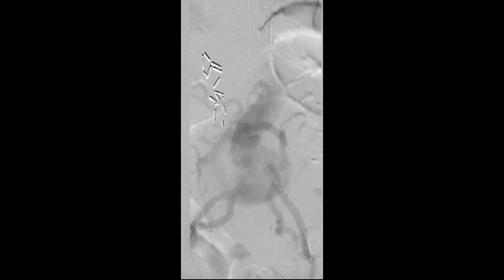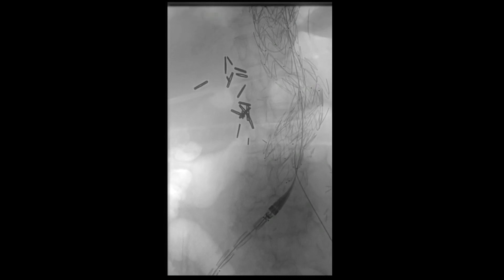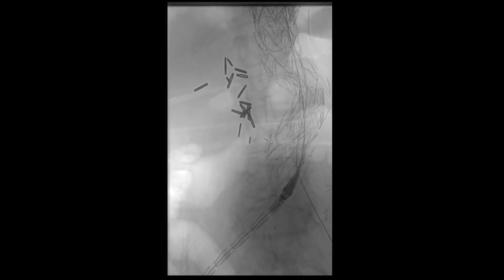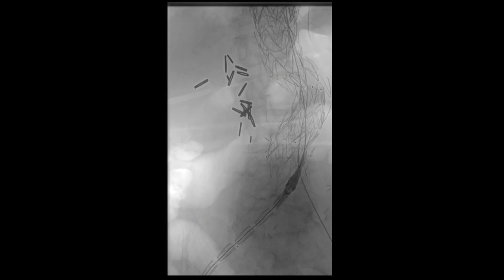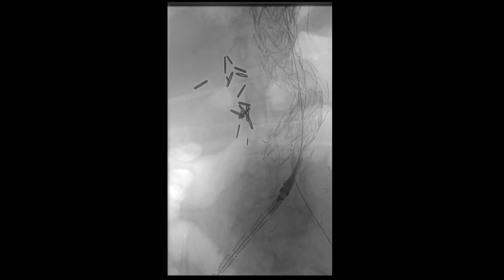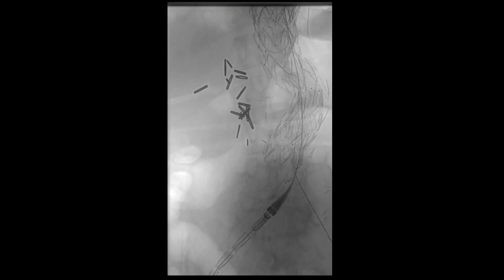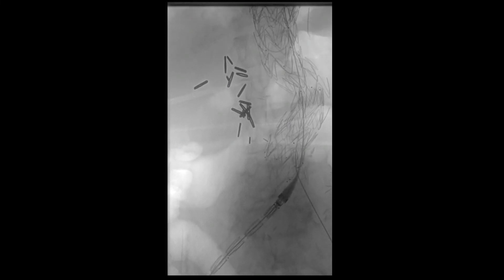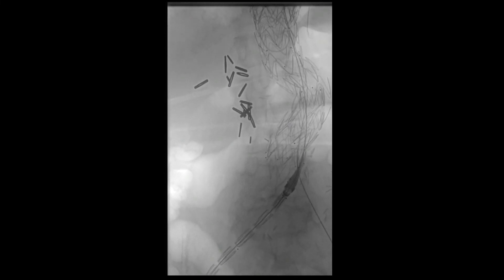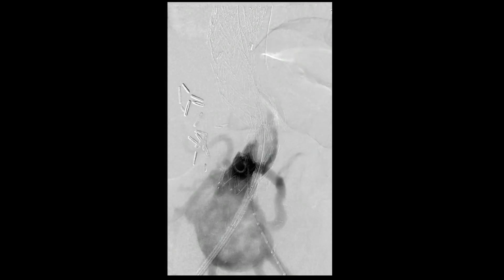Next, a super-stiff wire was introduced into the descending thoracic aorta, followed by introduction of a 28 mm Navion stent graft. The distal aspect of this stent graft was placed just distal to the previously placed endograft within the aortobiiliac graft. This stent graft was then deployed, and a repeat angiogram was performed that still showed active extravasation just distal to the stent graft.